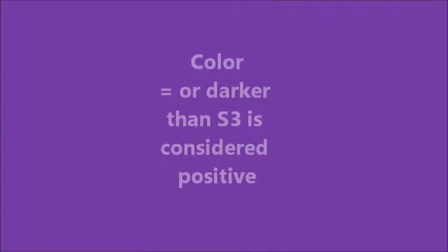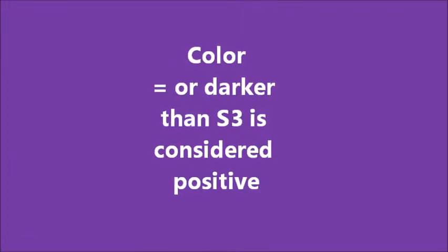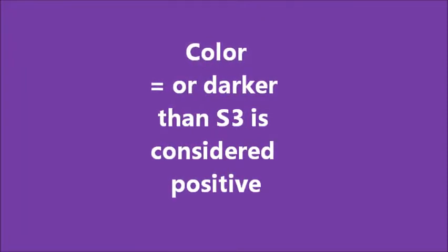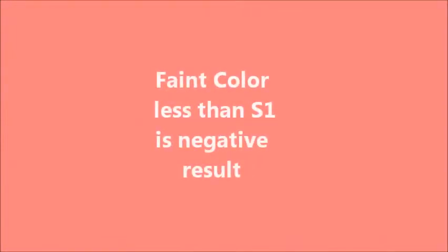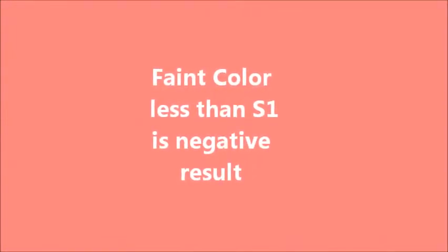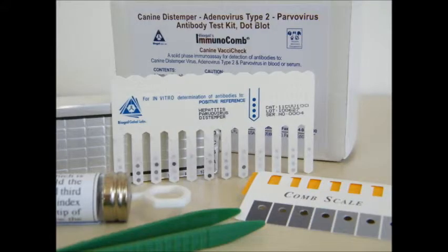A colour tone that is equal or darker than the reference spot is considered a positive response. Repeat this step with every test spot separately. A faint colour tone of S1 or less is considered a negative result. The results of the dry comb may be kept as a record, as the colour of the dots do not fade.